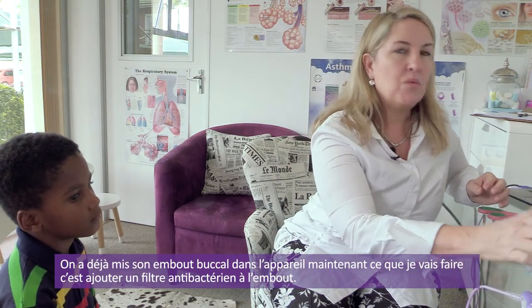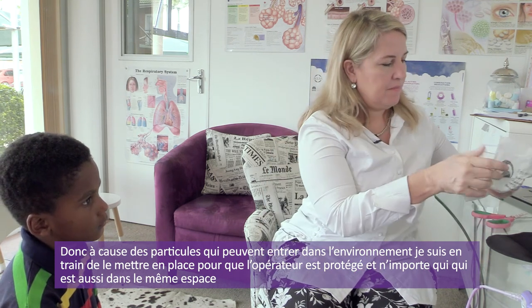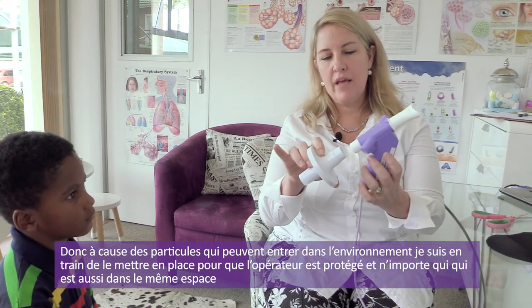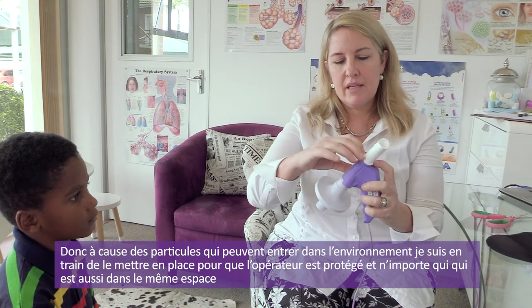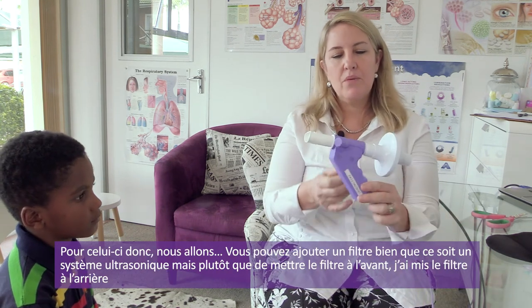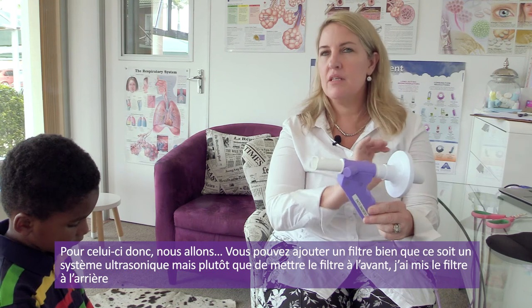Okay, so we are ready for Riley's test. We've put his mouthpiece in. Now what I'm going to do is add a bacterial filter to that circuit. Because of the aerosolized particles that can go into the environment, I am setting it up so that the operator is protected and anyone else in the environment. For this one, you can add a filter, even though this is an ultrasonic system. So rather than having the filter on the front, the filter is here at the back.